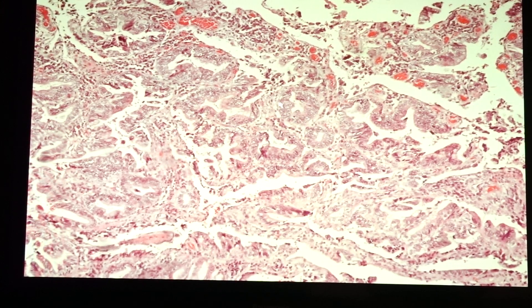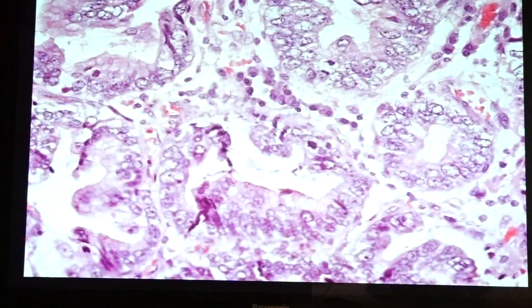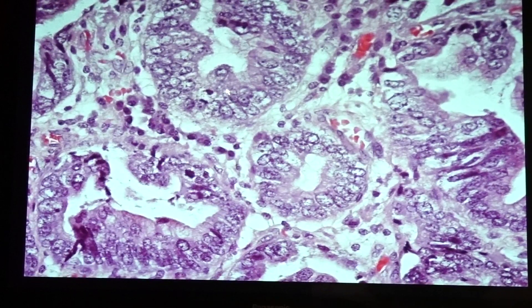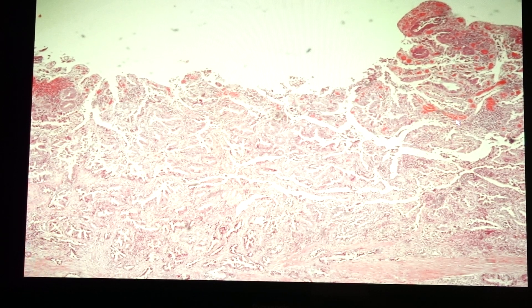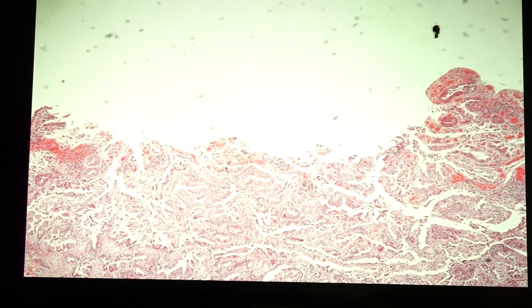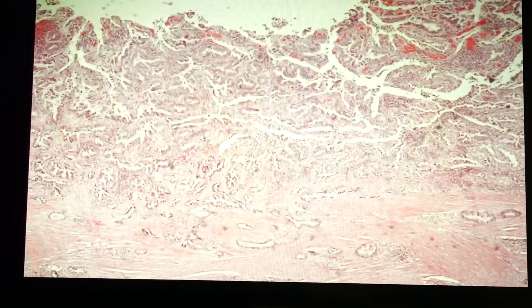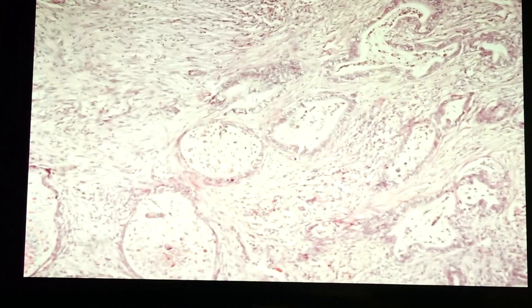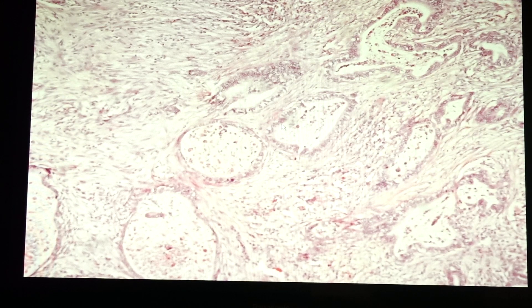There are atypical glands that are formed, lined by cells that possess pleomorphism of the nuclei and prominence of the nucleolus. There are two patterns of growth: one is exophytic, where it forms a polyp or pedunculated mass on the mucosa; the other is the infiltrative pattern, which is what we see in this case — atypical glands infiltrating or invading into the fibromuscular stroma.